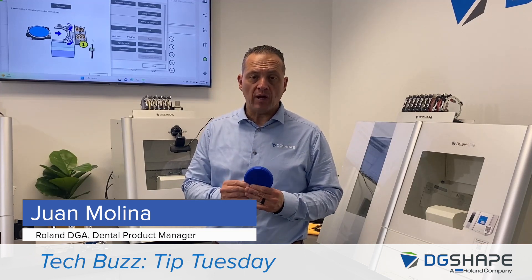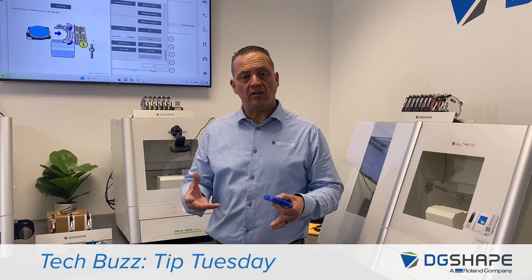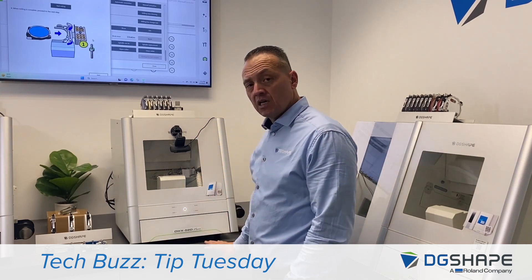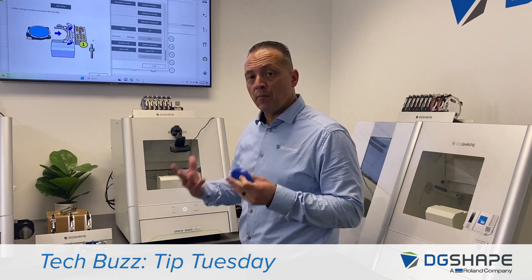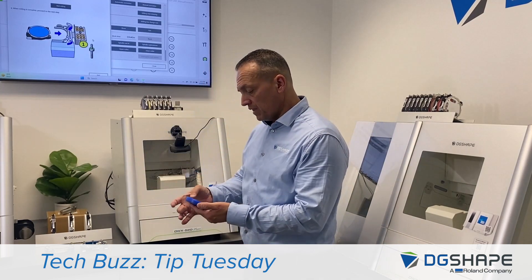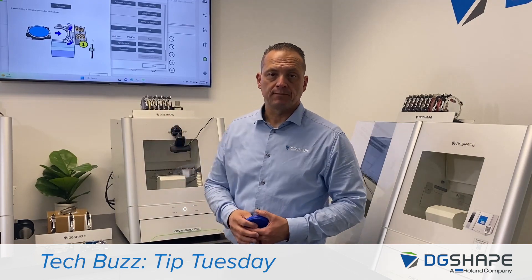Performing manual correction may adjust from any variables in milling accuracy. So if you require higher milling accuracy, we suggest performing the manual correction. We will use the 52D Plus output on a wax disc, but you can perform the same task on the 52D and 52D CIs. Once completed, we'll measure the results and input the values into vPanel. So let's get started.